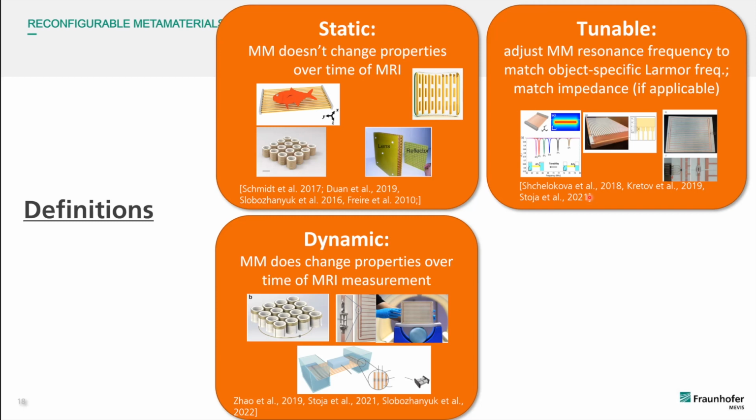They are just designed for a fixed frequency. We figured that for any clinical application, it will be necessary to have a tunable metamaterial. And it's tunable not only for the resonance frequency, but also if you want to match impedance, if that is relevant for the application.